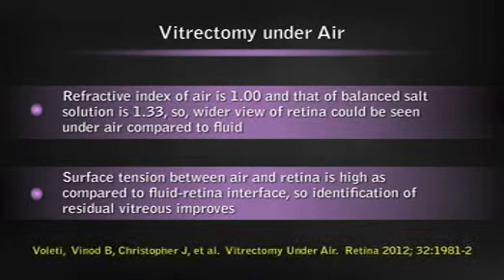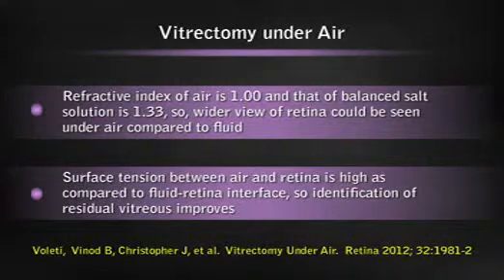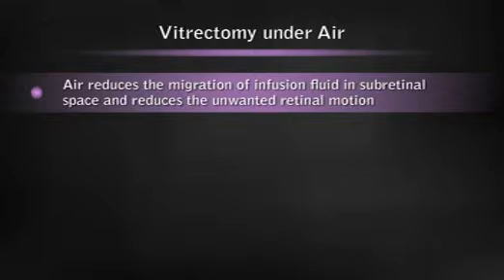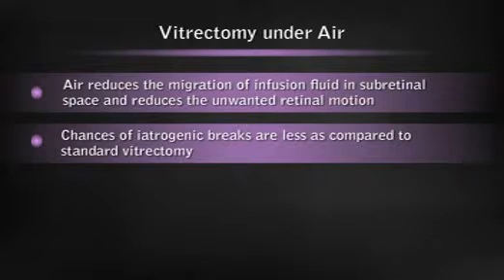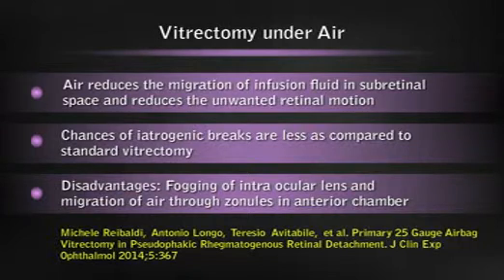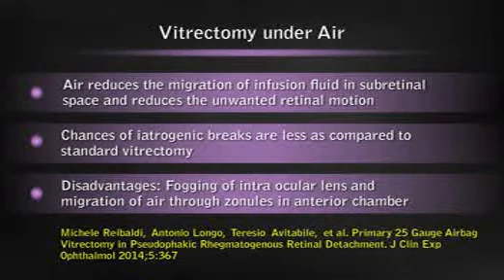The surface tension between air and retina is high as compared to the fluid-retina interface, and so identification of the residual vitreous improves under air. Additionally, air also reduces the migration of infusion fluid into the sub-retinal space. The chances of iatrogenic breaks under air are also reduced as compared to standard vitrectomy. The disadvantages of under-air vitrectomy include fogging of the intraocular lens during surgery if a posterior capsular lens is present, and migration of the air through the zonules into the anterior chamber.